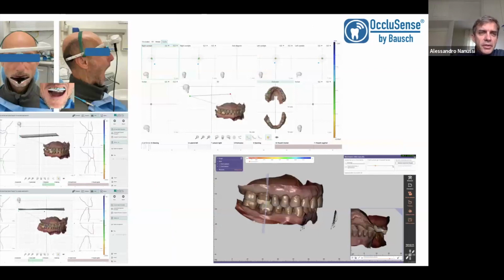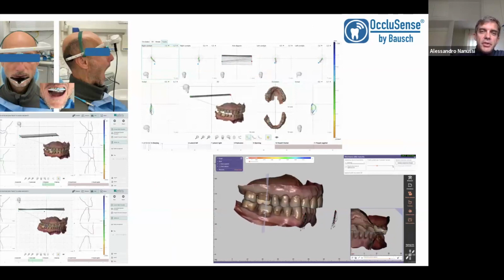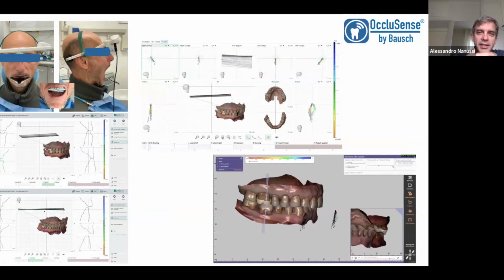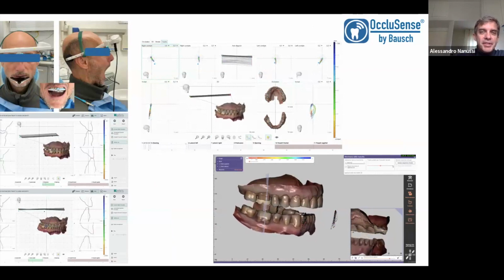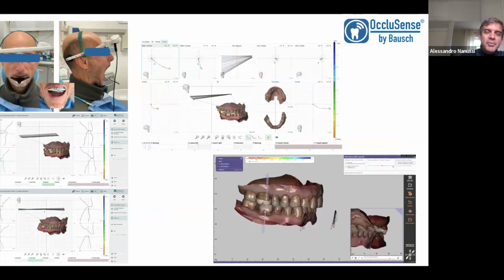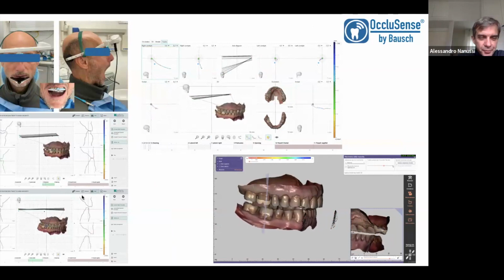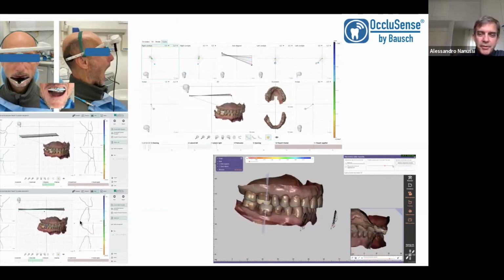Obviously, we can also record each movement of the patient, and we can create a perfect restoration that respects the movement of the jaw, not only in opening and closing the mouth, but also in lateral movements and in protrusion. We have the representation of the patient in our computer, and we can model and check each moment of the contact. Here you can see the slide cut of the teeth of the patient, but it's not enough.